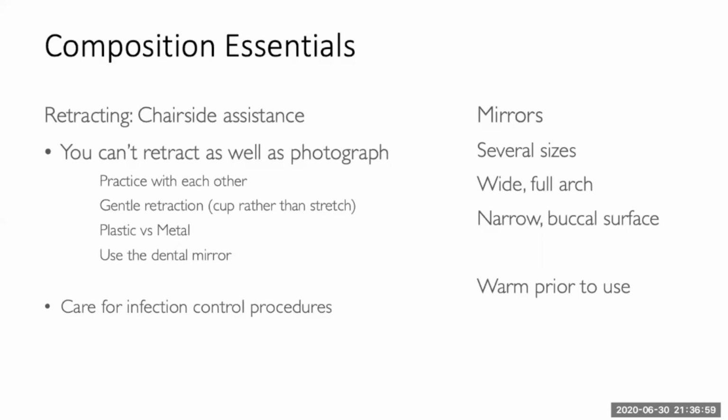But remember to warm them up a bit beforehand, because you don't want the patient's breath frosting the mirror just as you're about to take a photograph. And that left-hand bottom dot point, in a COVID world, we need to think about infection control, which I'm sure you will be.